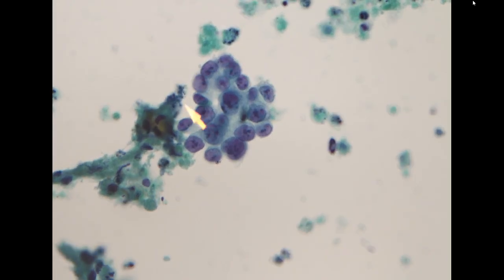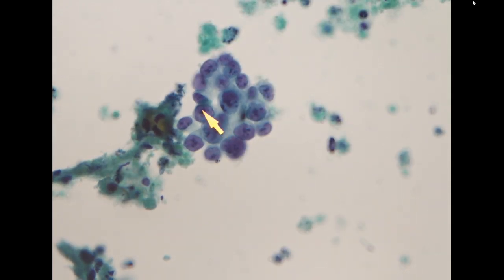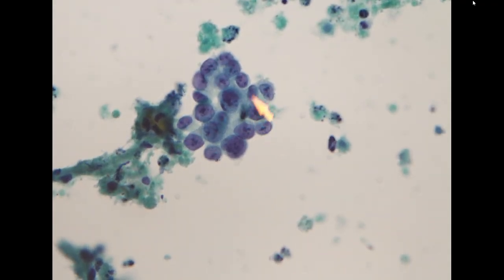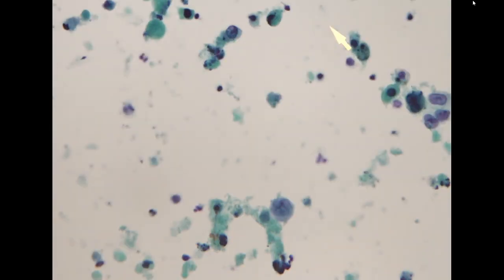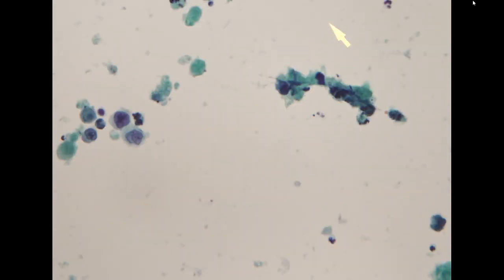And we still can identify some well-preserved glandular cells with vesicular chromatin and prominent nucleolus. So this is an adenocarcinoma cluster. So we see adeno and we see a marked necrotic background. So this is positive for adenocarcinoma involvement, but this is just way too cellular. So I think the patient won't last for long. Yeah.